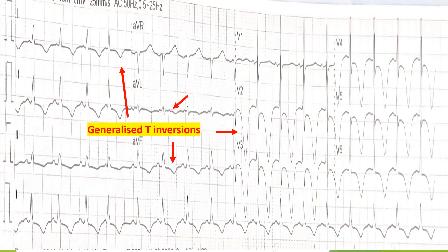One important point to understand is that these T wave inversions are not localized to some areas — they are more generalized in nature. We can see T wave inversions in the lateral leads: I, AVL, V5, V6; the anterior leads V2, V3, V4, V5; and the inferior leads as well. This means this is a process that has involved the heart globally.